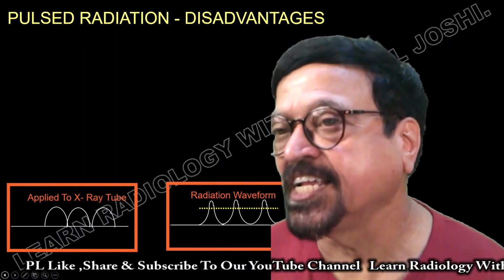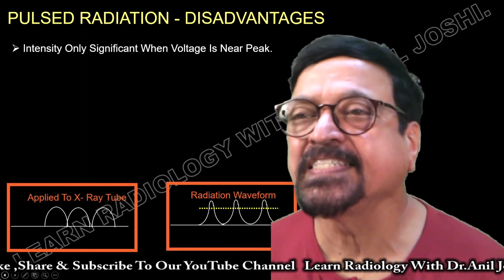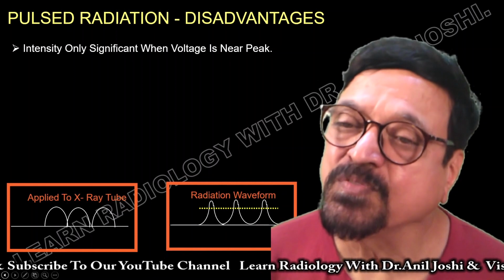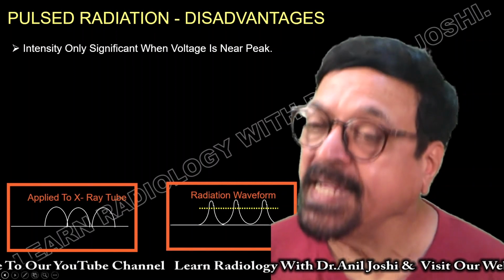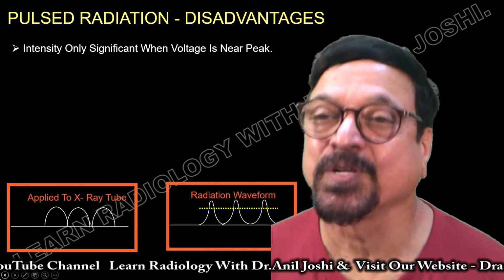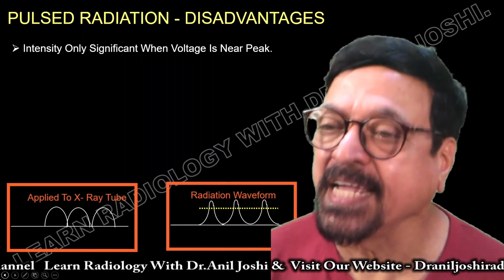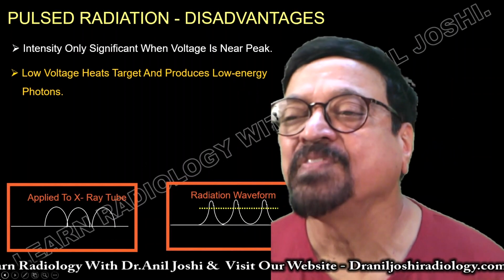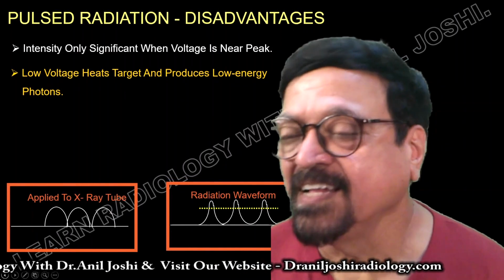Now pulse radiation. Intensity is only significant when voltage is near peak. This is one of the disadvantages, because whatever is not at peak is not used effectively for X-ray production. So otherwise it is waste, or it can produce X-rays of low kV.